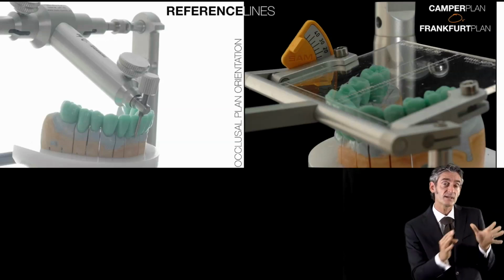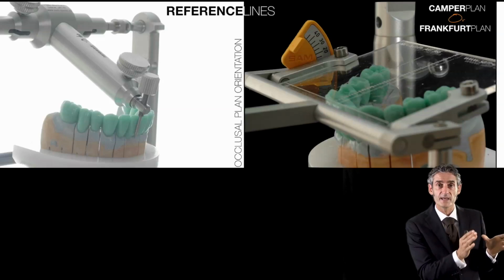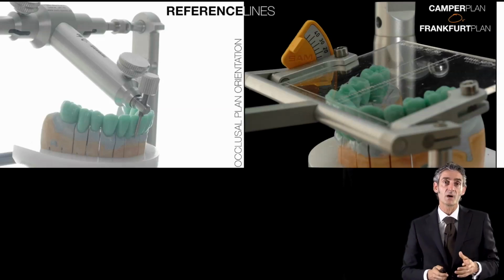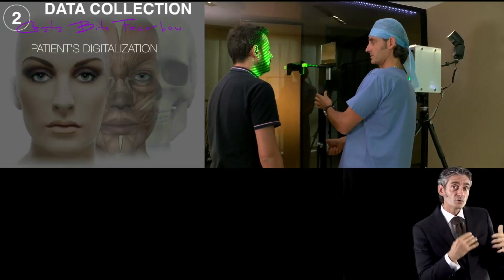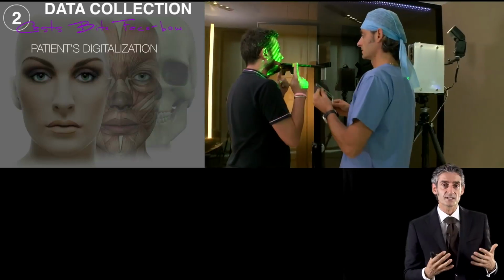Okay, this is important. If we give only the facebow to the technician, but we don't give any input to use this kind of tool, for example, our occlusal plane will not be well oriented. So right now I'm going to show you the difference in what we can do with digital dentistry.